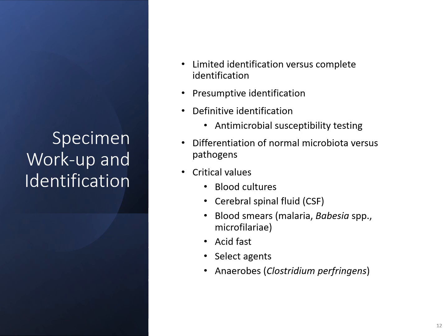So if you're doing a spinal fluid in the micro lab and you do a gram stain and you see organisms in that gram stain, then you need to call the physician and alert them versus reporting it in the computer. Something like a urine culture would just be reported in the computer and the physician would get the results and see them, versus having to call a urine result.